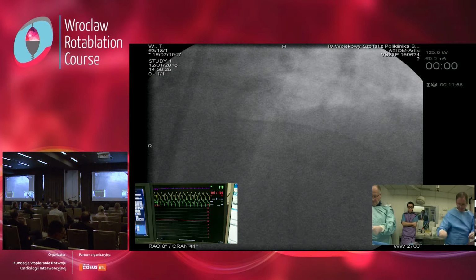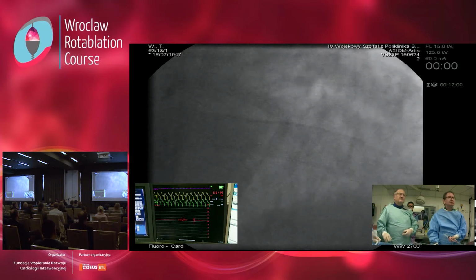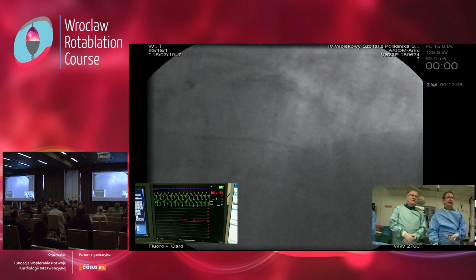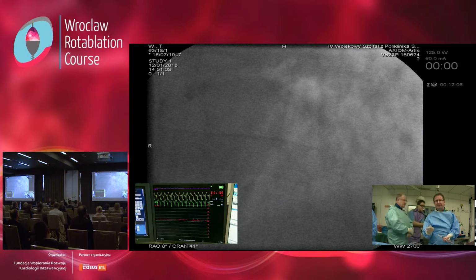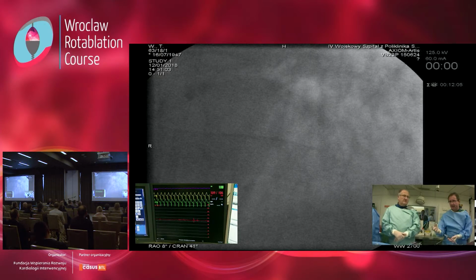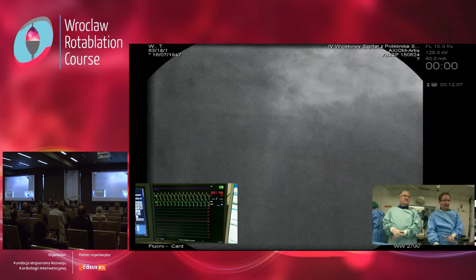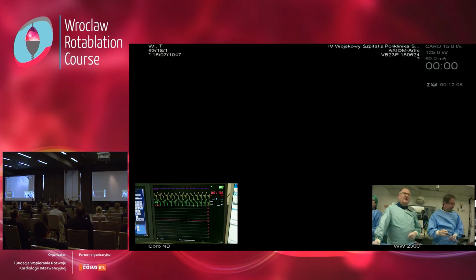It happens sometimes, yeah. And StentBoost will be very, very helpful here in this situation, because it's not easy to see. If you take Synergy or Integrity, you don't see so perfectly. Maybe a movie without contrast. Yeah.